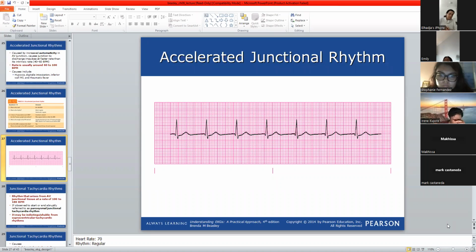Mark, are you there? Yes, I'm here. Sorry, I'm having some issues with my Wi-Fi. Okay. Emily, are you there? Yes. Can you go by this strip?